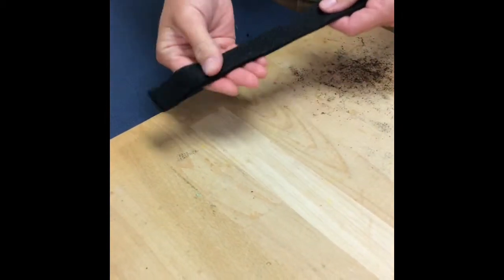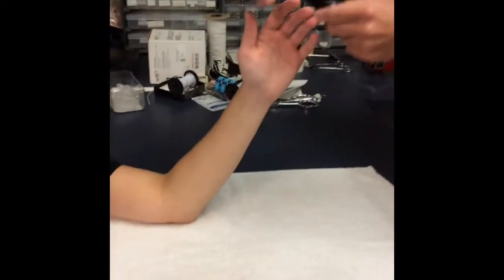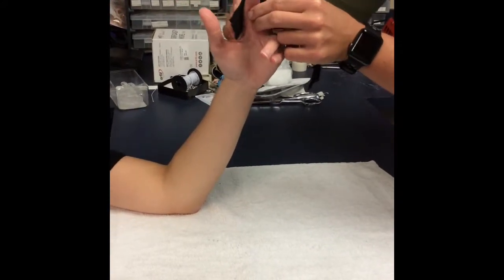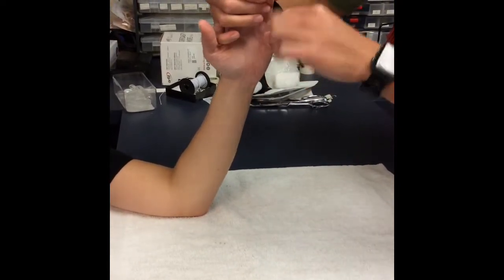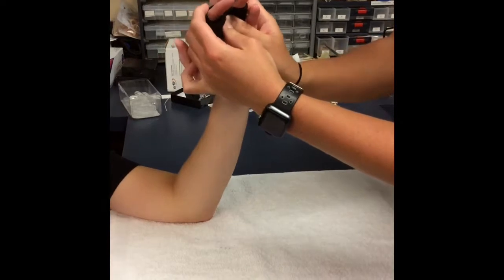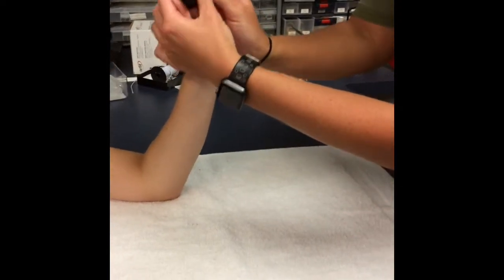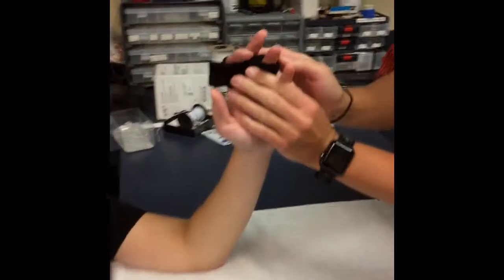Then you want to make sure it's cooled down before placing the patient's involved finger — going around the index finger and around the ring finger, making sure the middle finger is in 30 degrees of extension, and also making sure to clear the PIP joint.